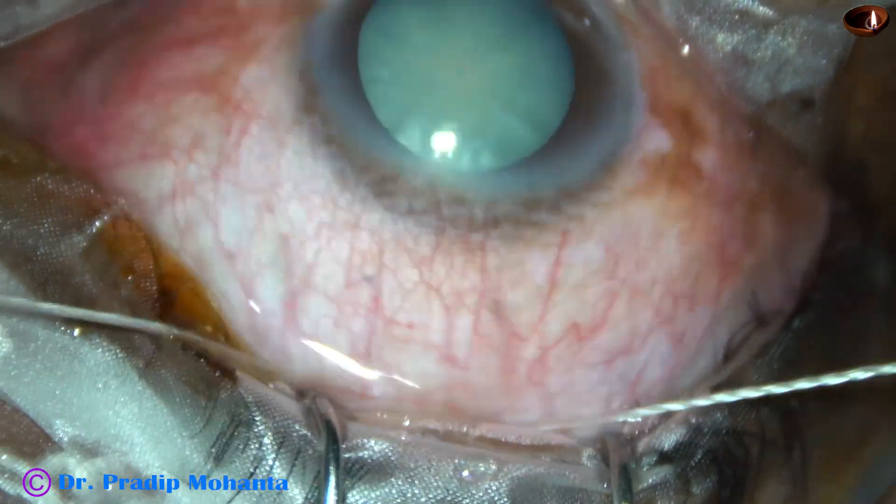Now mild wet field cautery is done to have a very neat and clean surgical field where bleeding will not disturb the dissection. This is very mild wet field cautery.